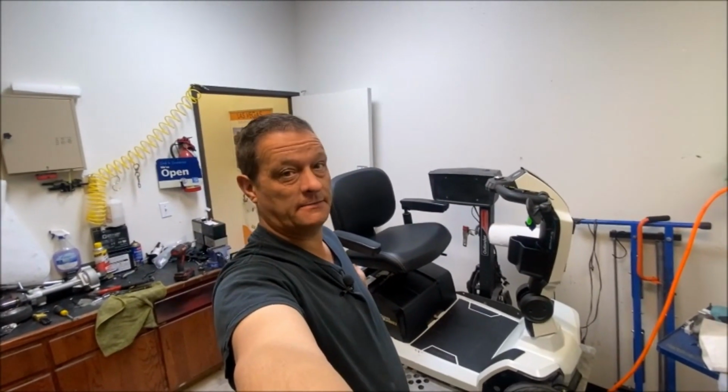Hey everybody, it's Ian at Las Vegas Scooters and Lifts, and today on my lift I'm going to be doing a service on a ZT10.